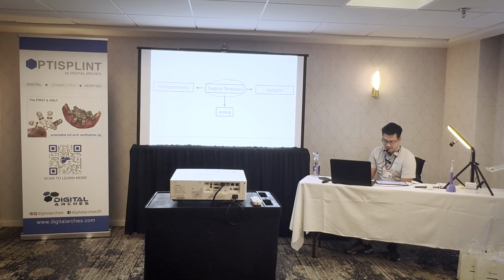So analog. In terms of analog, your startup cost is basically zero, because you've got a denture, you go in there, they're paying for components, it's basically just your labor. You can bring a hand piece or whatever, but startup costs for analog conversions are basically minimal. We just totally ignore that.